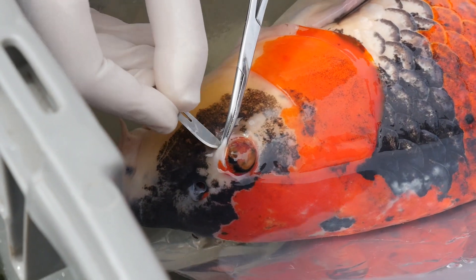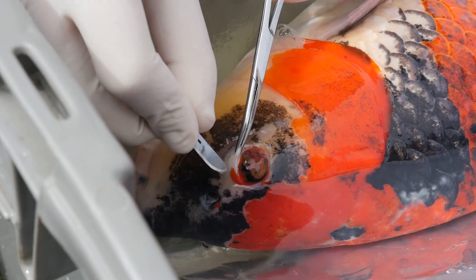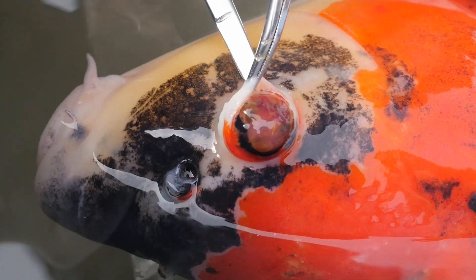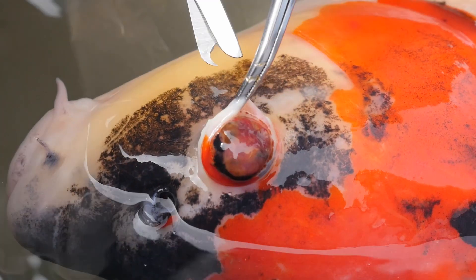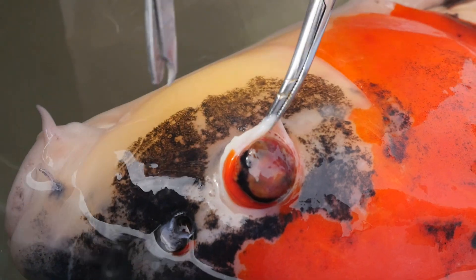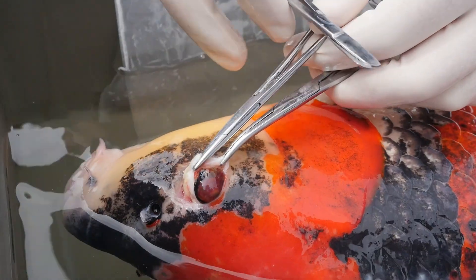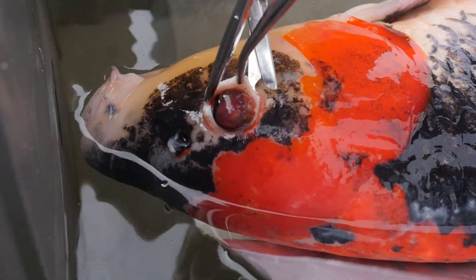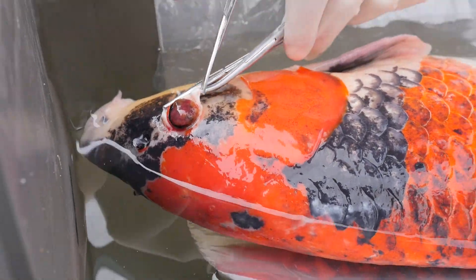Right now I just have to cut the conjunctiva that's around the eye. What I'm really trying to do is get access to the blood vessels and nerves that run behind the eye so I can clamp them off. That way they won't bleed when I pull the eyeball out. Some of the really big tumors are very hard to get out in one piece, but there's a lot less chance of infection if I can get it out in one piece.